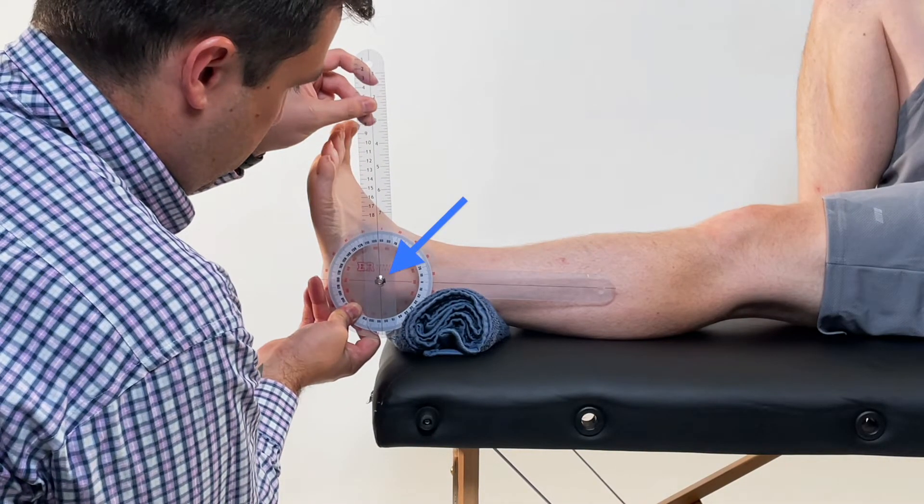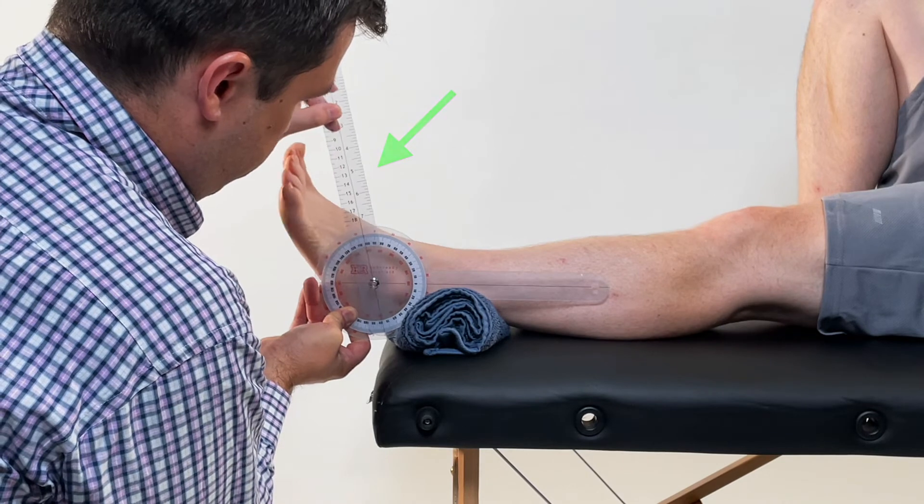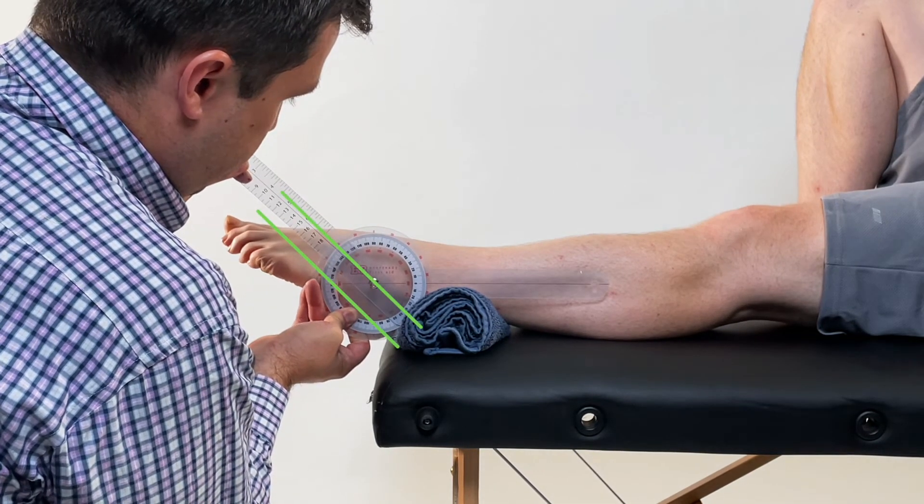Align the goniometer just inferior to the lateral malleolus. The stationary arm should be parallel to the fibula and the movement arm with the sole of the foot. Make sure to keep the movable arm parallel to the base of the foot and not bending with the tarsals and metatarsals.